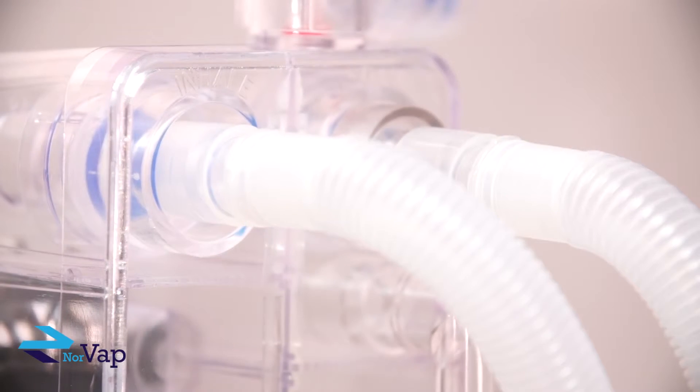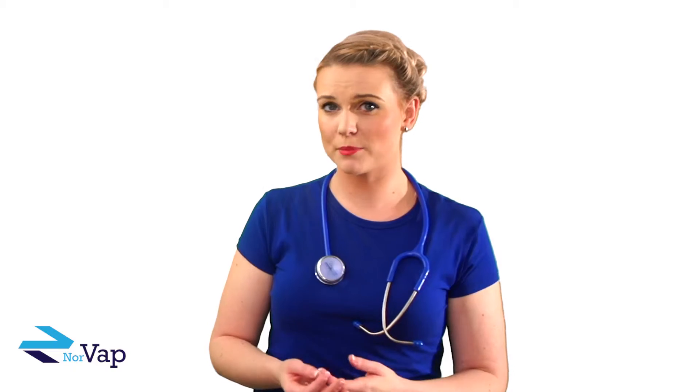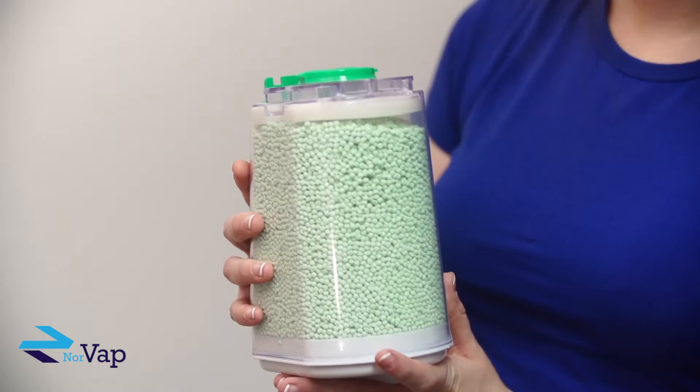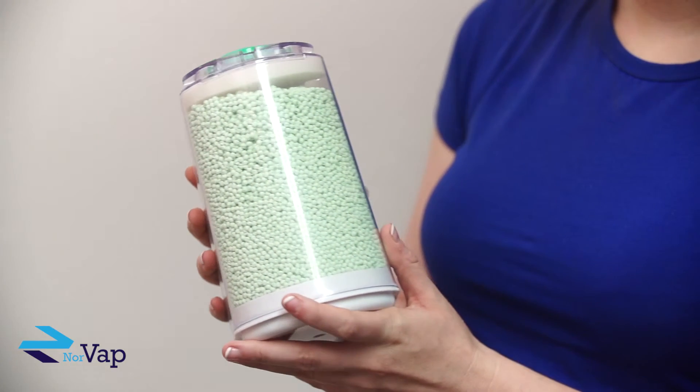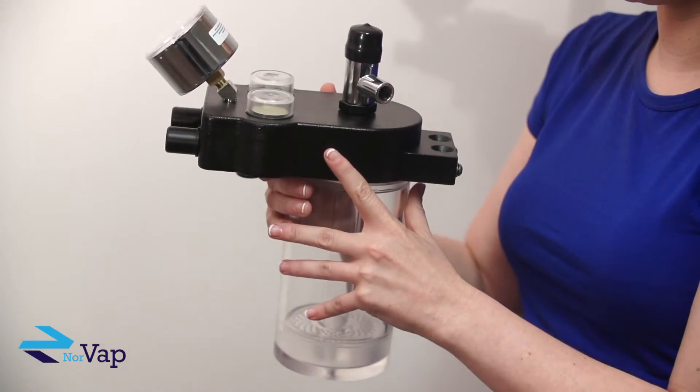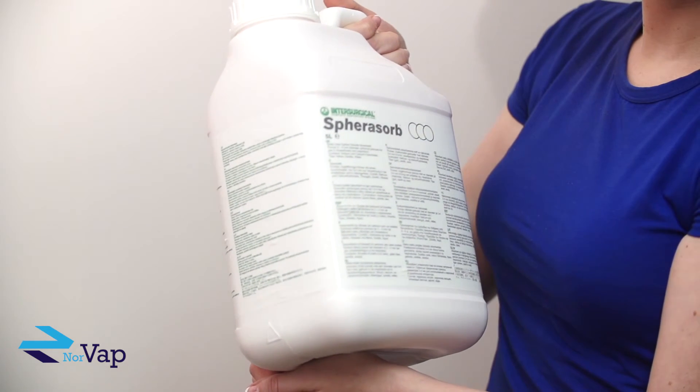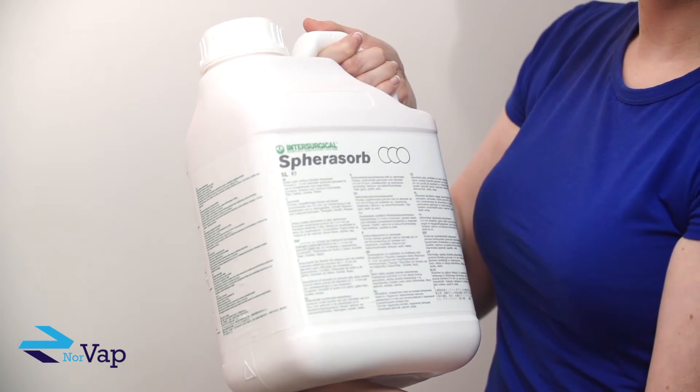Many anaesthesia breathing circuits require the use of chemical absorbent to filter out CO2. The absorbent comes in a granular form and can either be disposable, such as this one, or reusable, as this example here, which is refilled with these granules. The granules need to be checked before each use.